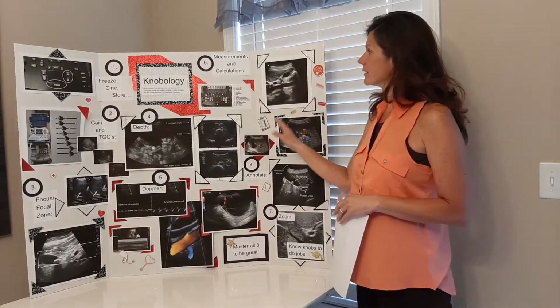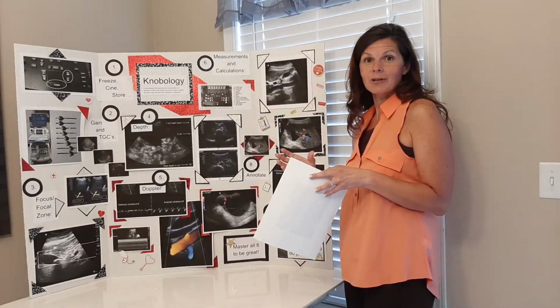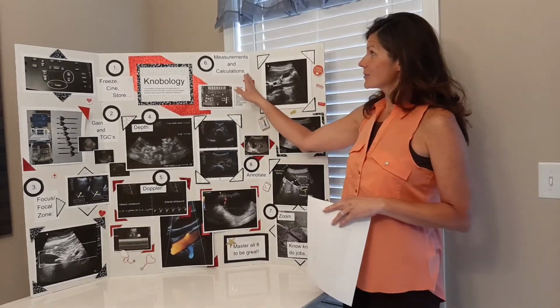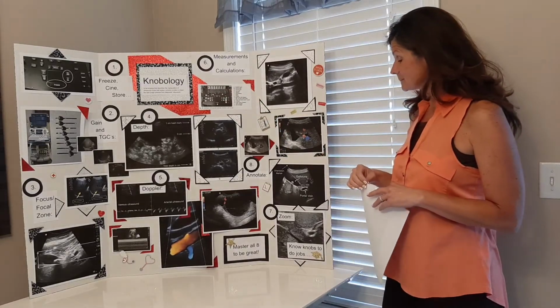All of these measurements go into the calc package, which is saved into the report, and the radiologist will have all of that information on the last screen of the ultrasound exam. And you obtain all of those by pressing the measure or the calc button on the machine.